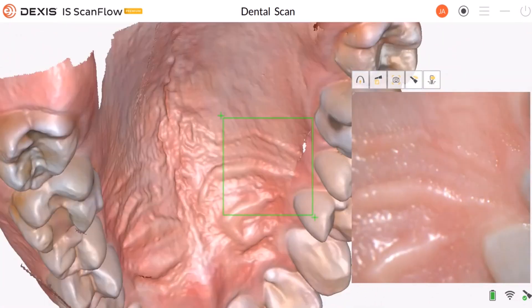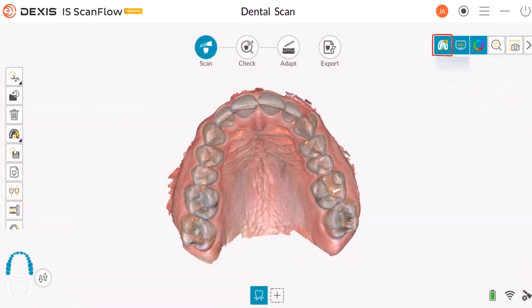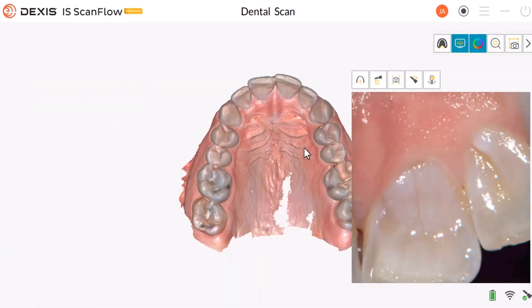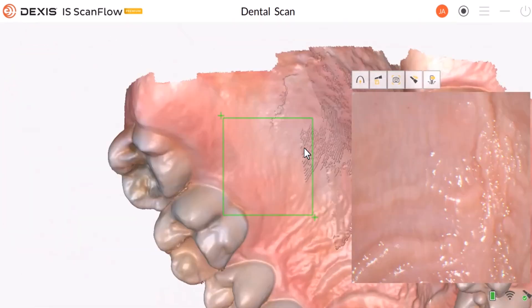If you notice some missing areas of the palette, the AI Soft Tissue Removal may be set to on. Click here to turn off this feature. Finish scanning the missing area after turning off the AI Soft Tissue Removal feature.